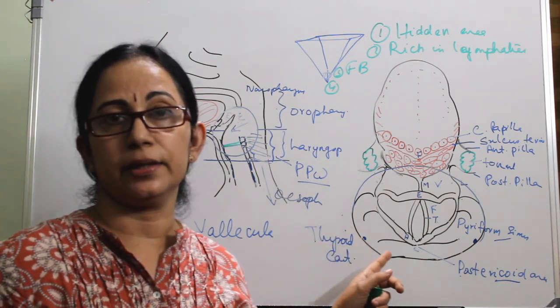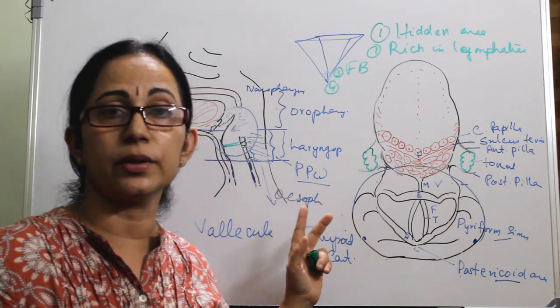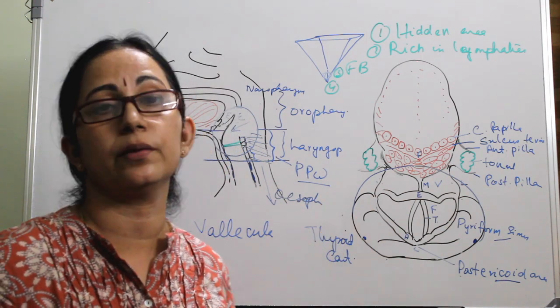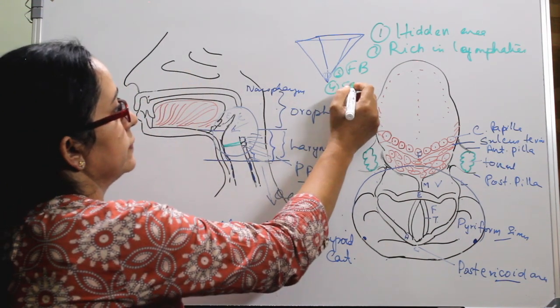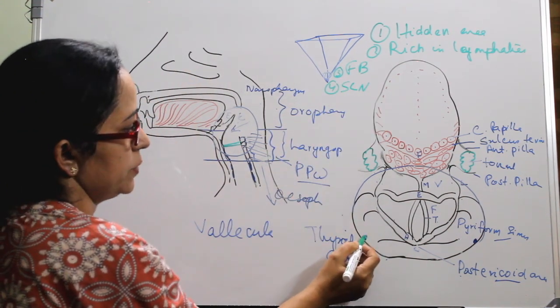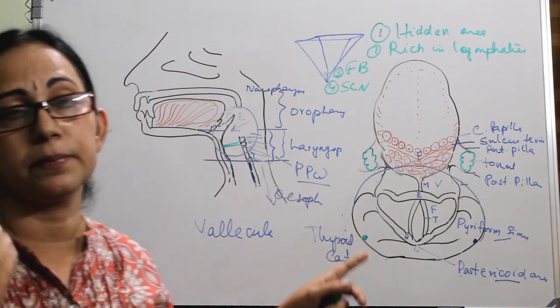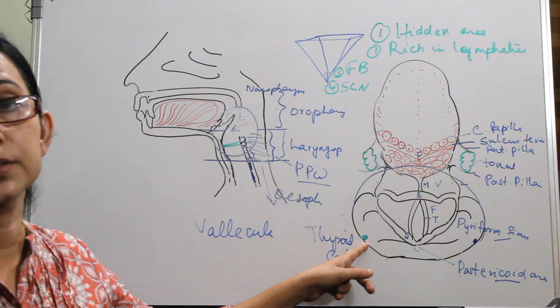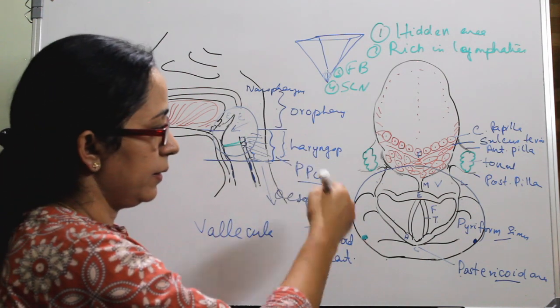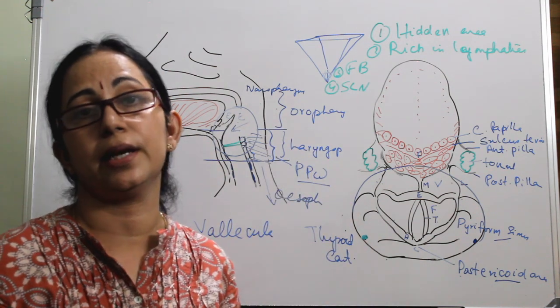one superior laryngeal nerve seen under the mucosa of the lateral wall of pyriform sinus. Superior laryngeal nerve. This part. Superior laryngeal nerve is present behind the mucosa on the lateral wall of pyriform sinus. So, we can anesthetize superior laryngeal nerve.